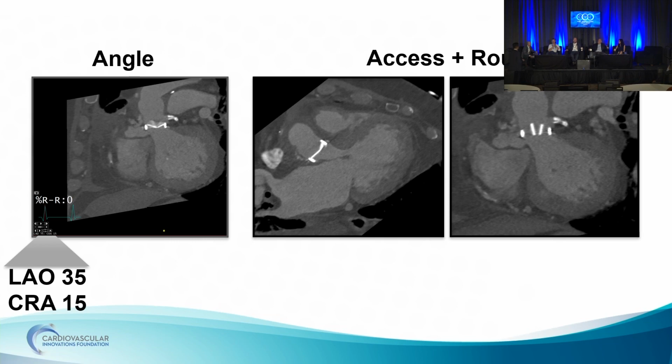How would you size your ADO2 based on this dimension when your leaflets are open? So the ADO2, the discs are +6, right? And the biggest waist is 6 millimeters, and this is a 6x6 if I saw that correctly. So I'd probably start with a 6.6 ADO2, or maybe you could do a 6.4 if you didn't think it's very deep. And then you just have to see if that 12 millimeter disc is interfacing with the leaflet. If it's not, you're done. And if it is, then you have to reconsider. But that's the nature of closure devices, that it's sort of empiric.